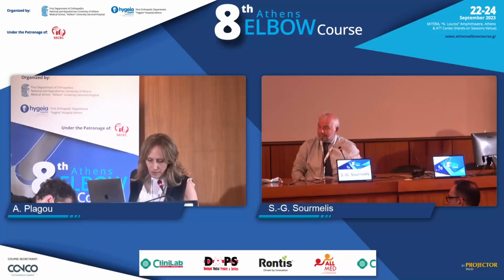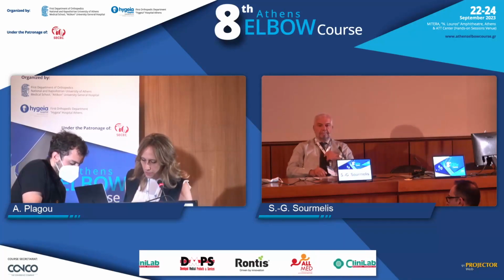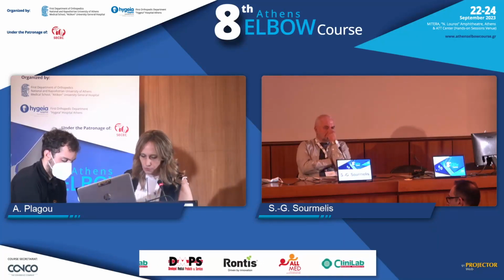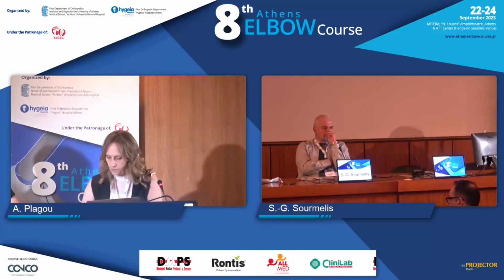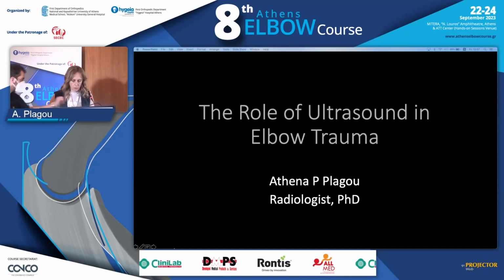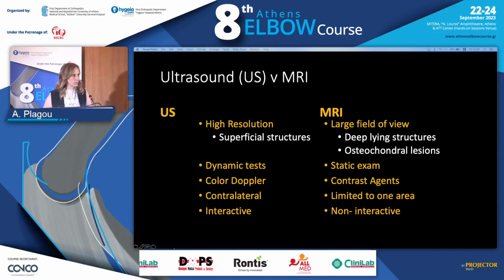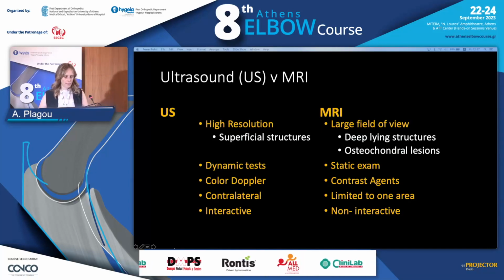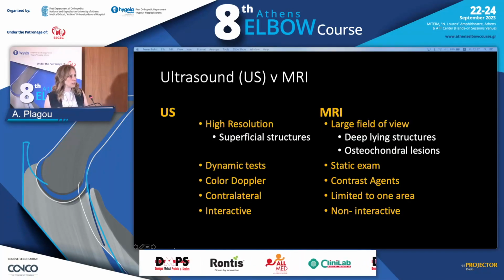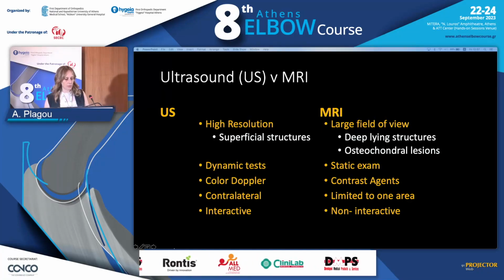I'm happy to speak about ultrasound of the elbow in the context of trauma. Elbow trauma. And as the audience is a clinical audience, I'll just try to highlight the indications of ultrasound compared to MRI. We spoke about CT, so we are now going to speak about tendons and ligaments and compare the two methods.